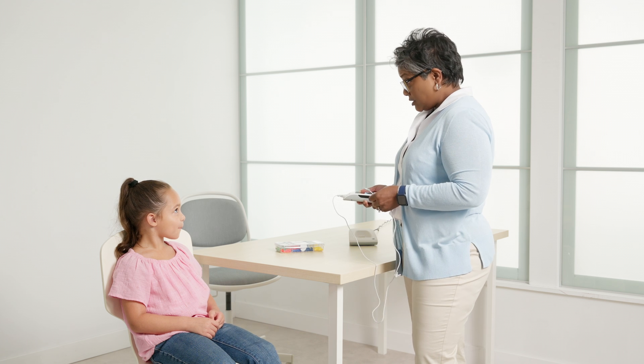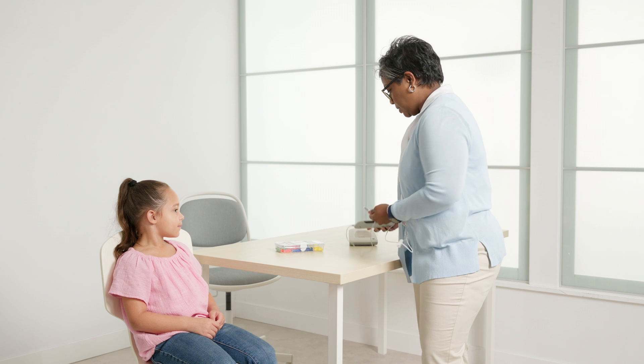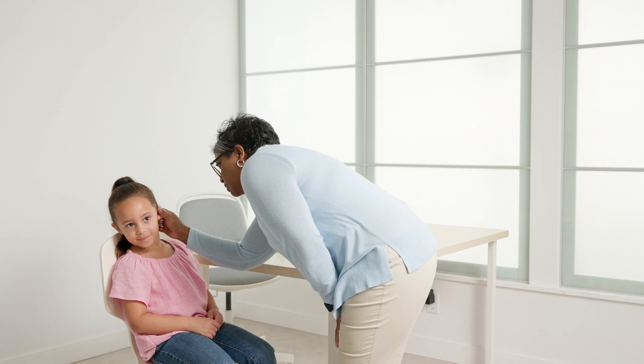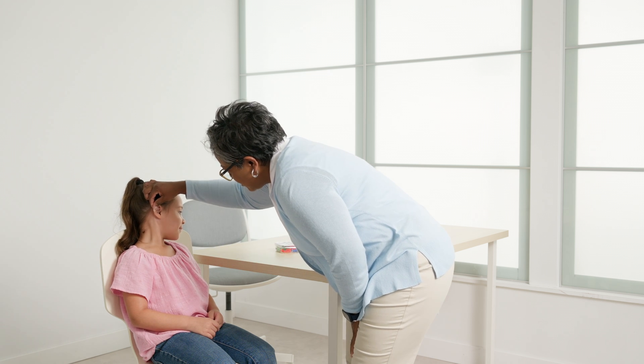Instructing small children about DPOAE screening is quite simple. You just need to pleasantly tell children that you will be checking how their ears are working. The child doesn't need to listen for any sounds or tell you if they hear a sound — they just need to sit quietly for a short time. Typically, the small blue, yellow, or green ear tips accommodate most ear canals of children ages 3 to 7.